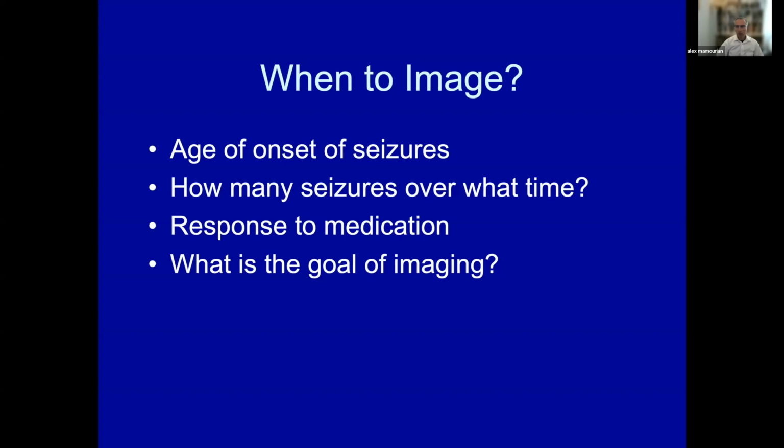And I think that one thing that I've seen in my own practice is the overuse of imaging. The patient who is 30 years old, is at a party, drinks too much, has something that resembles a seizure, comes to the emergency room, and they order an elaborate MR evaluation of the temporal lobe looking for a seizure focus. That's really not appropriate. So we're looking at patients who have epilepsy, but epilepsy meaning seizures over a long period of time. I think strictly speaking, the diagnosis of epilepsy can be applied with 2 or more seizures, but really we're looking for patients with long-standing seizures.